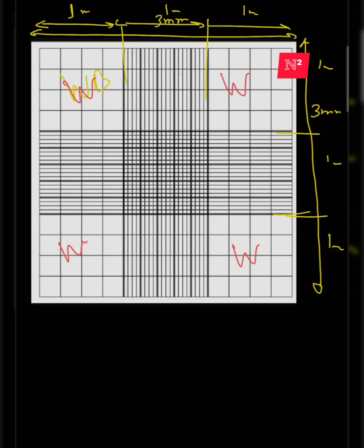In the very center of the grid, you can see there are some small grids. This is called the RBC counting area. Here we do all our RBC counting, only this area that I'm showing you. Here the RBC, the platelet, the sperm count, even leukemic WBC count is done.